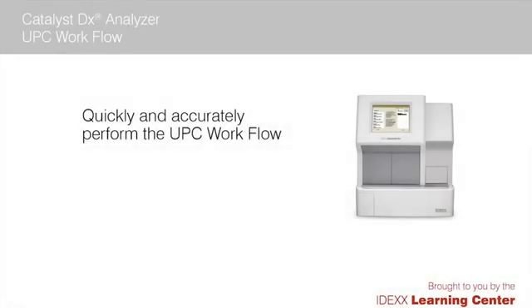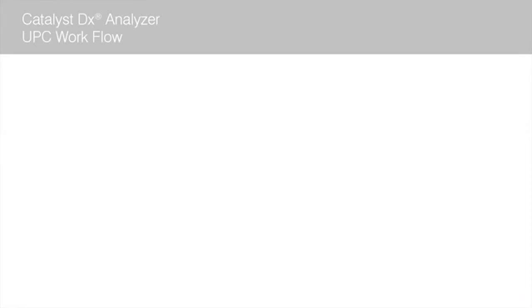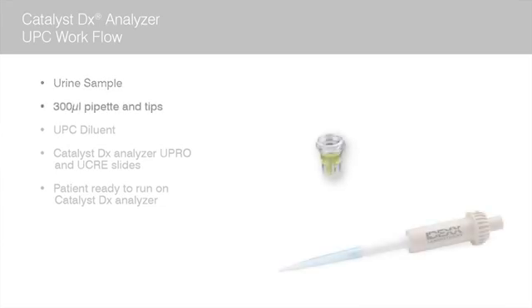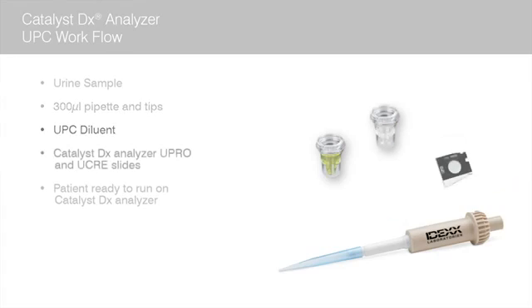In this video, we will demonstrate the proper way to run a UPC workflow on your Catalyst DX chemistry analyzer. Before you begin, make sure you have the following supplies and equipment on hand: a urine sample, a 300 µL pipette and tips, UPC diluent, and UCRE and UPRO Catalyst DX slides.